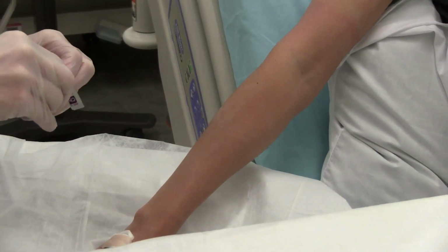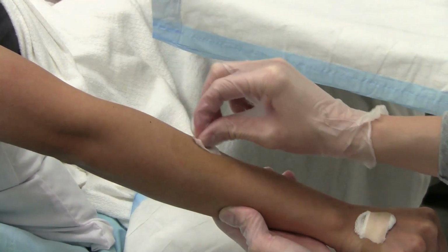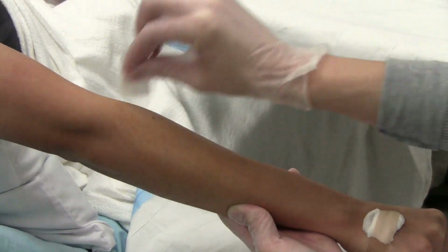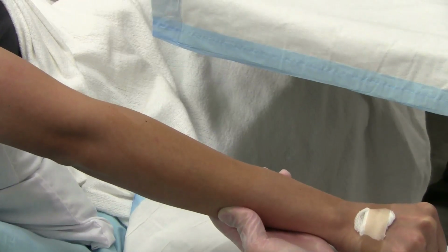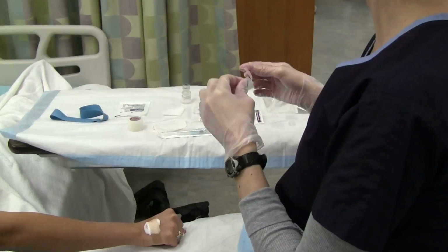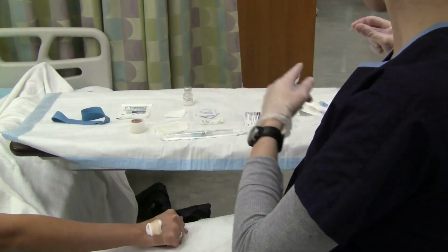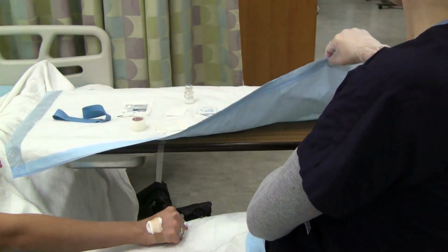Apply clean gloves and clean the venipuncture site. Clean the skin at the site of entry with a topical antiseptic wash. Use a circular motion and move from the center outward for several inches. Allow the solution to dry on the skin. Prepare your saline lock tape.